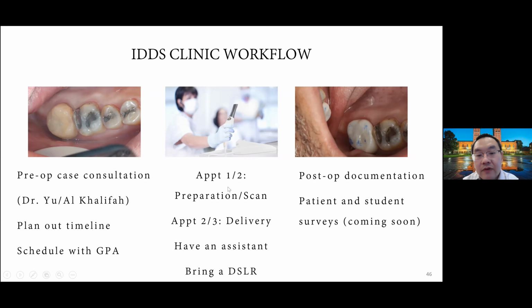For the appointment itself, we're going to try to do everything in that clinic, including the preparation. If you're really fast on the preparation, we might be able to do the scanning at the same appointment too. It's not like you have to have the patient's crowns already prepped. You can just come in with a brand new tooth and start preparation. If you don't finish the preparation, we won't go to the scan. We'll bring you back the next week and do the scan.